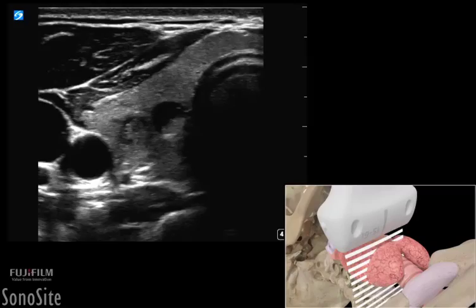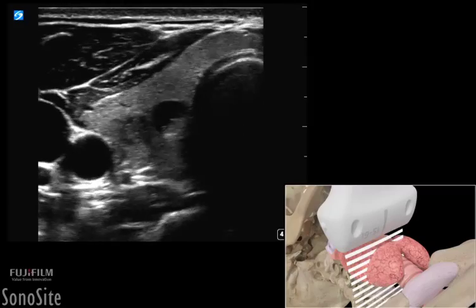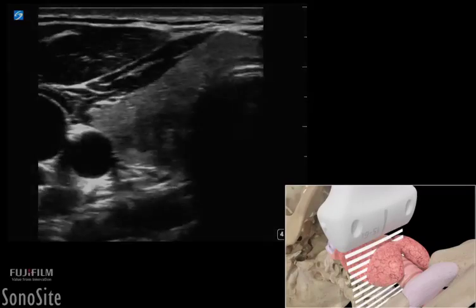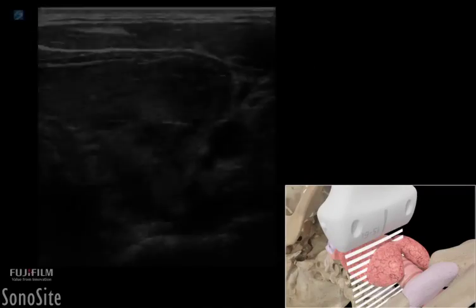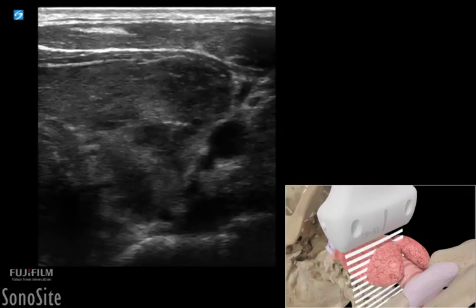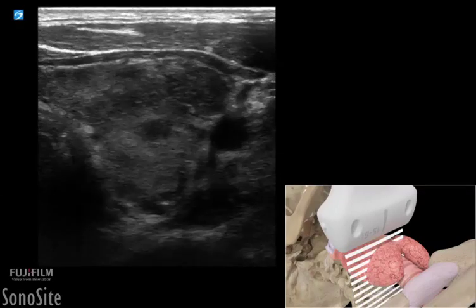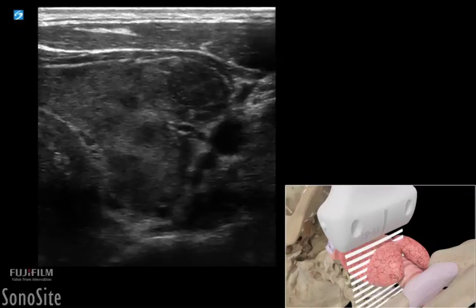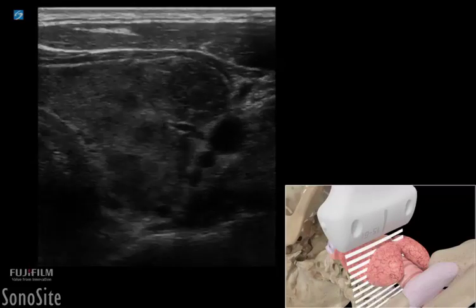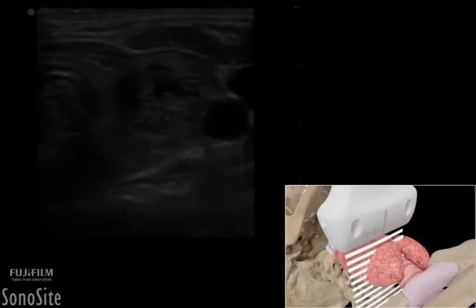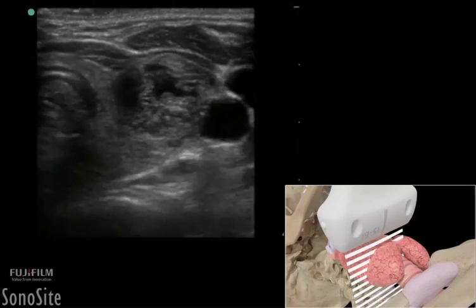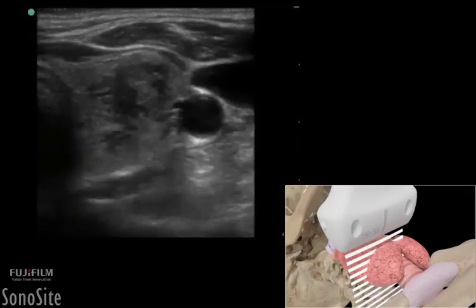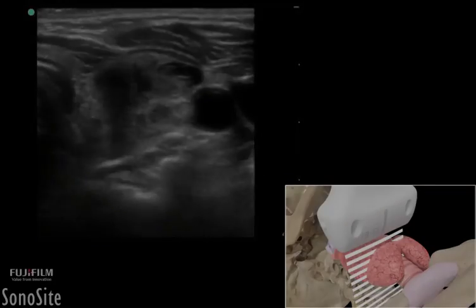When evaluating the thyroid, the size and number of nodules should be documented. A thyroid gland with multiple nodules, or goiters, are the most common cause of thyroid enlargement and appear as multiple heterogeneous nodules with little to no normal anatomy seen.